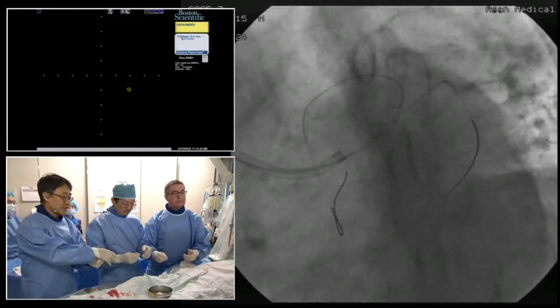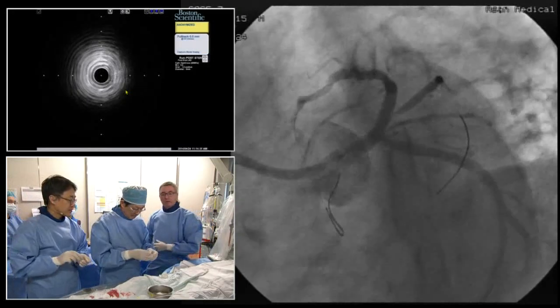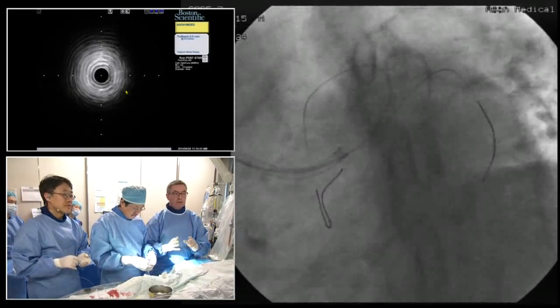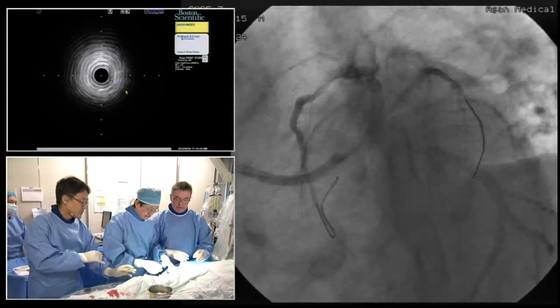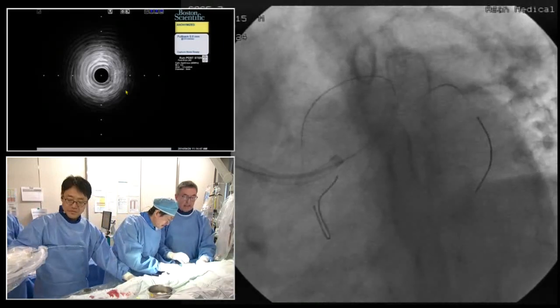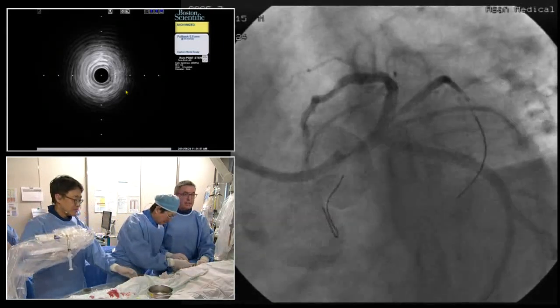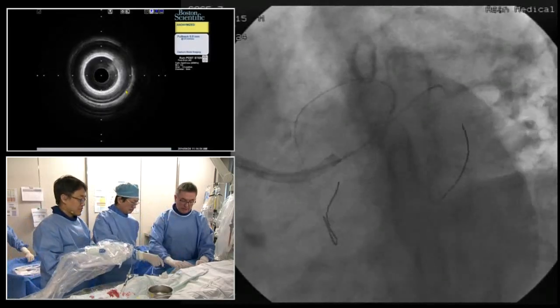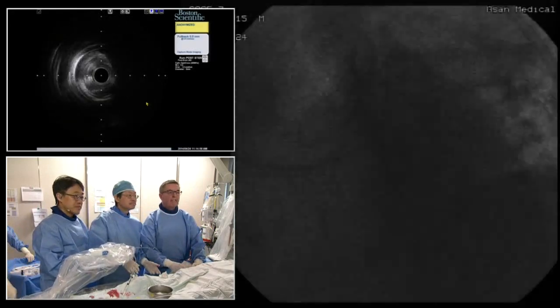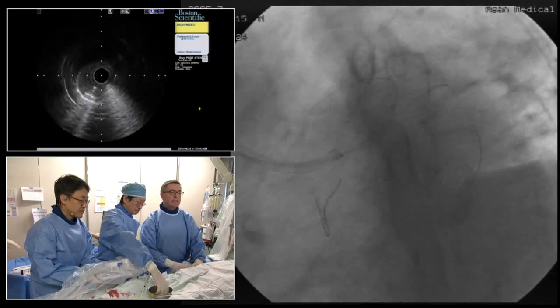So you think that the diagonal changed much after this? Yep, that has, but there's good flow there, and this is a very narrow angle. It's a discrete lesion, good flow, no dissection. We'll have a look in other views. But what we want to do here, Maurice, is actually do no harm if we can possibly get away with it. Now, if we need to do a balloon dilatation there, we can. Of course, we can check that with FFR as well. It's a very discrete lesion, and part of that will be carina shift, just knowing that the plaque volume is pretty significant.